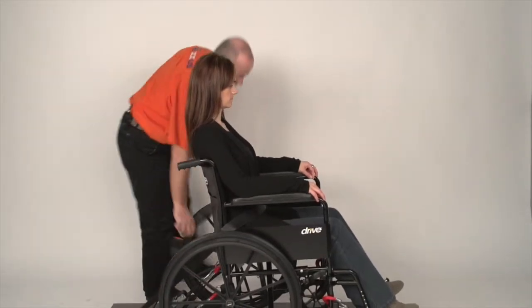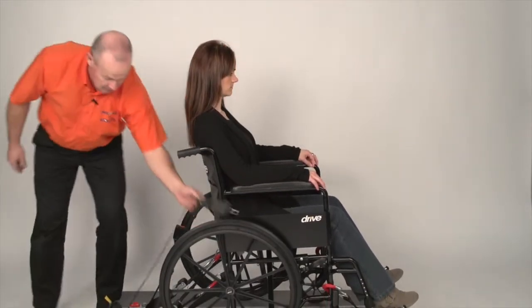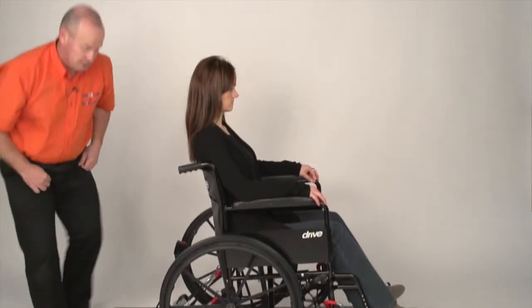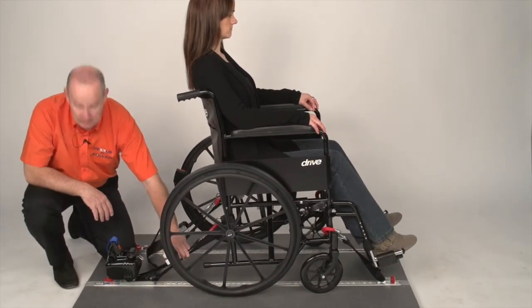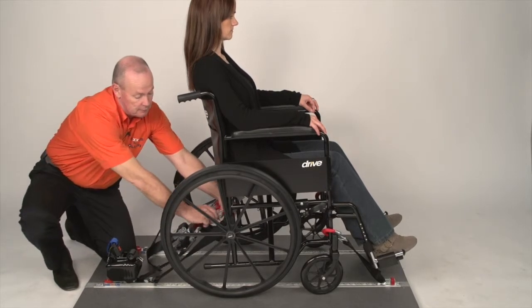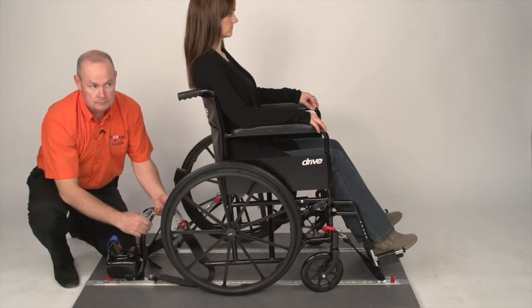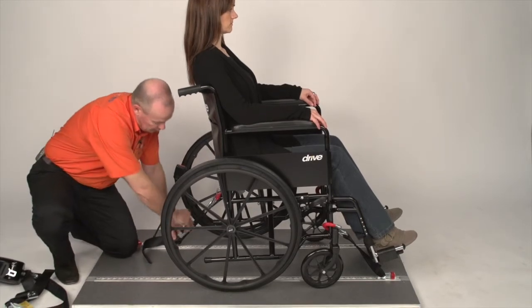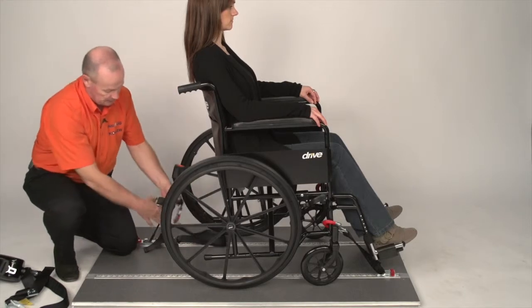Take hold of the lap strap, come underneath and back. To remove the Nexus, push the red bar of the over-centre buckle up, remove the carabiner from the ring, take off, join, and close. Then open the buckle, remove the hook, close the buckle, and remove the clip.